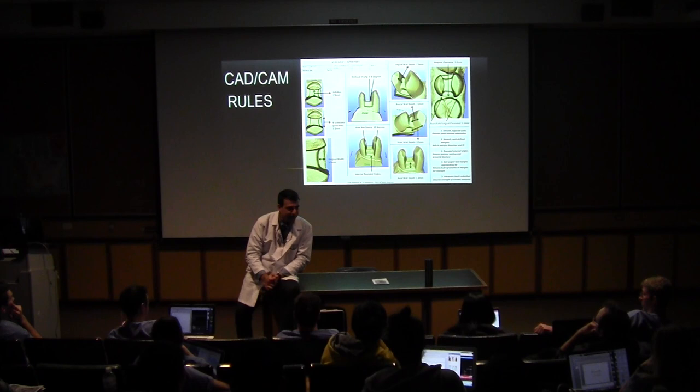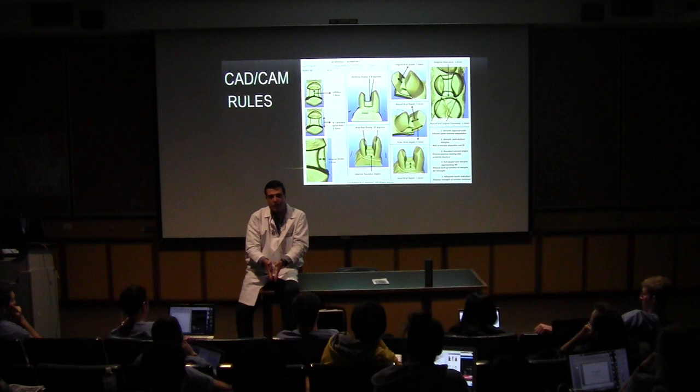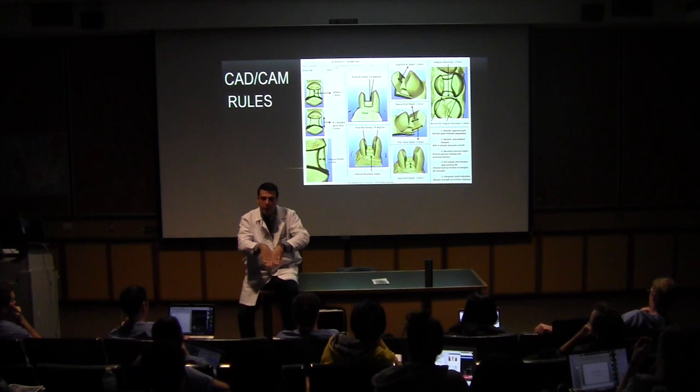Why is clearance so important for scanning using a CAD-CAM machine? Because you need a contrast. You need to have a clear margin space, right? Otherwise the camera won't get that information, and we call it bridging teeth. You won't have the room, the space in between teeth. There's no way you can draw the margin.